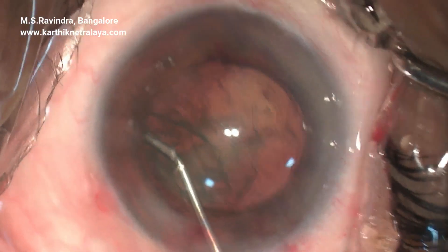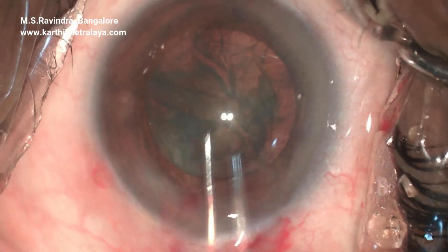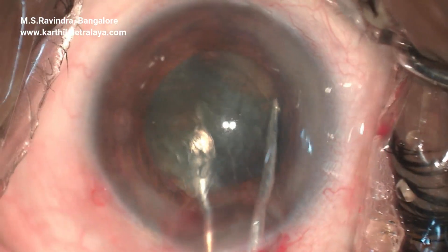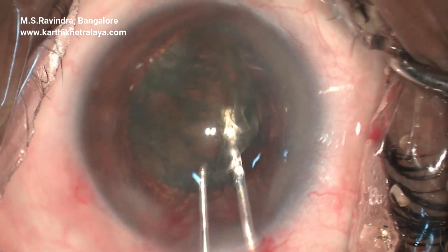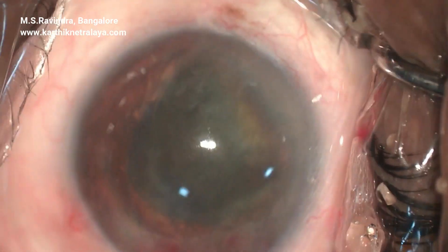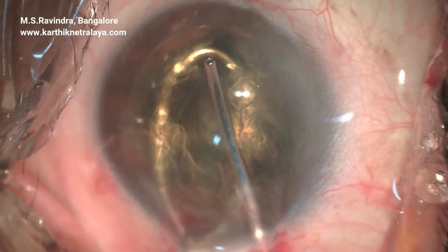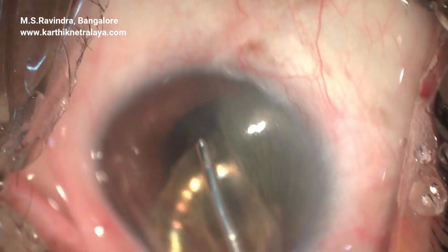The nucleus is rotated and lifted up into the anterior chamber after doing a good capsule separation with hydrodissection. The nucleus is now bisected using a visco-infusing 25-gauge cannula, and as the nucleus moves, it is separated from the endothelium by HPMC, hydroxypropylmethylcellulose.